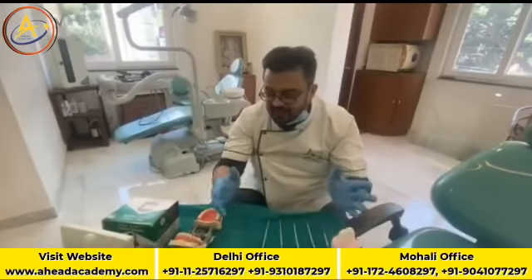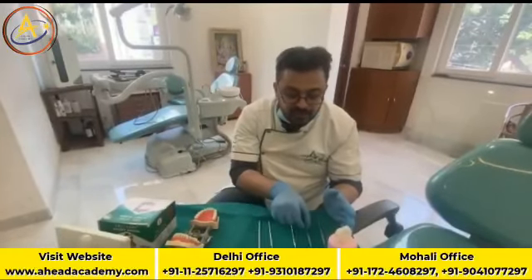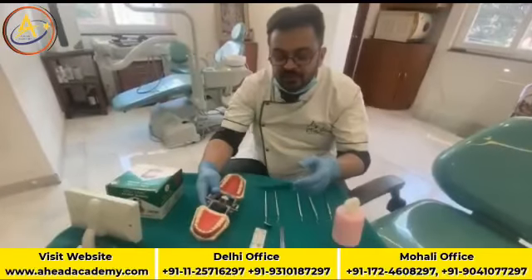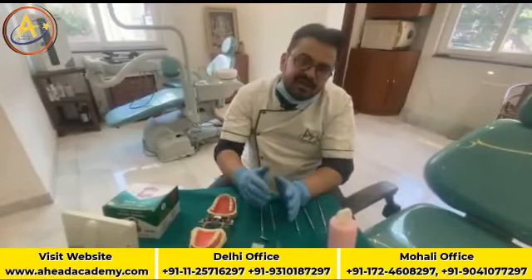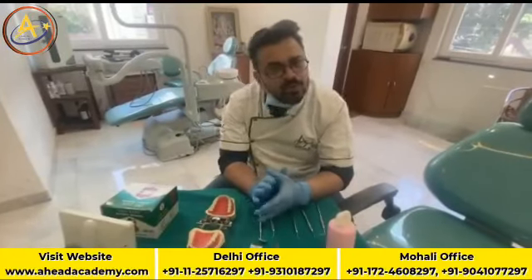Today, as you see, I have all the instruments: your mouth mirror, probe, explorer, and the typhodont jaw set. So today I am giving you a small insight into what probing is and how probing is done in normal patients, in clinical patient diagnosis, and it will help you further in diagnosing all your daily patients in your OPD. So what is the probing depth?